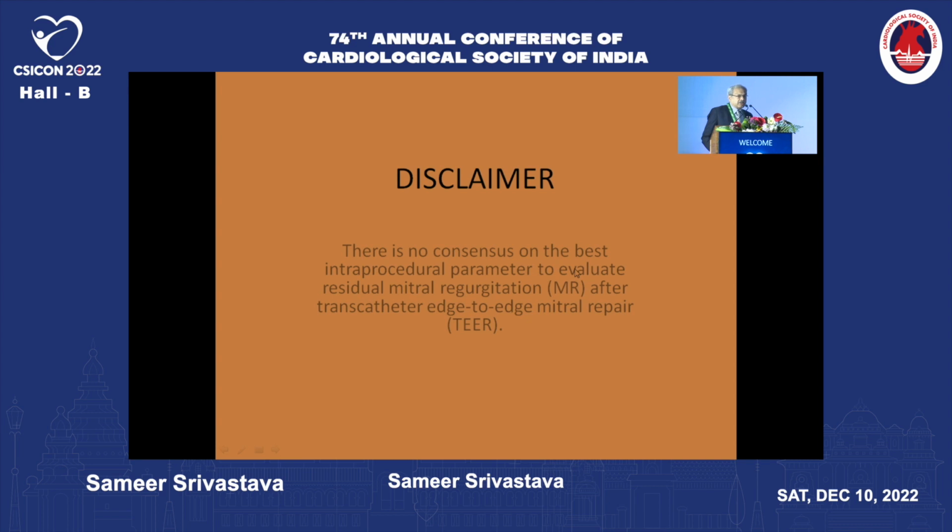Okay, so let me start with a very, very bold statement. There is no consensus on the best intra-procedural parameter to evaluate residual mitral regurgitation after TEER. All of us entirely depend upon our visual impressions, which are by far probably the best. But unfortunately, a novice who knows nothing about it and is just about to start needs some objective parameters to say what is the quantum of residual MR.